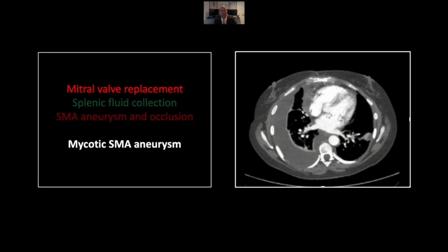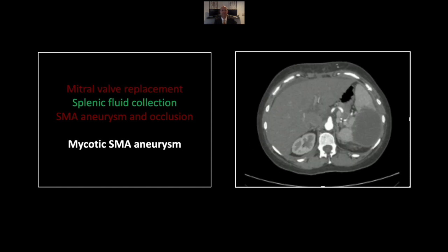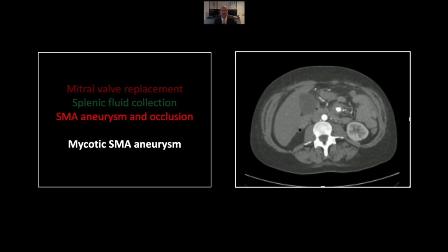Our next case is a mycotic superior mesenteric artery aneurysm. Note the mitral valve replacement — a very important finding, always included on abdomen and pelvis CT scans, and a very important diagnostic clue. This patient is clearly at risk for endocarditis as well as distal embolic phenomena. There is a subcapsular splenic fluid collection, which in these circumstances is concerning for an abscess. And lastly, distally along the course of the superior mesenteric artery, there is a focal irregular dilation with significant surrounding stranding and distal occlusion of the SMA, consistent with a mycotic aneurysm.